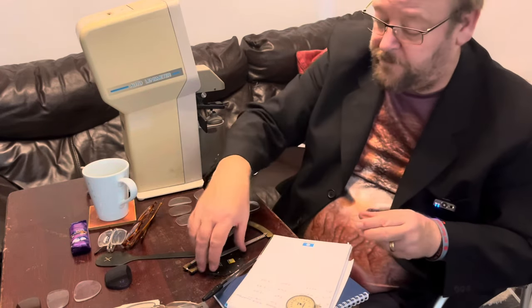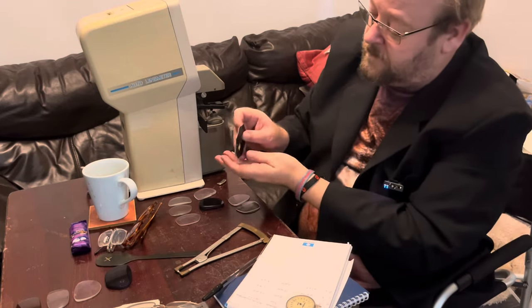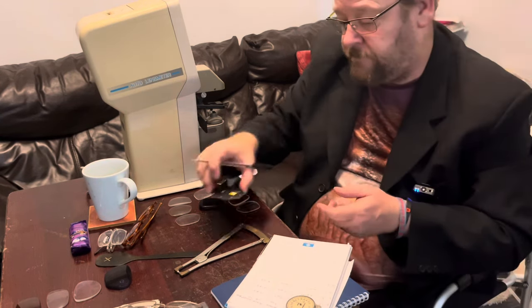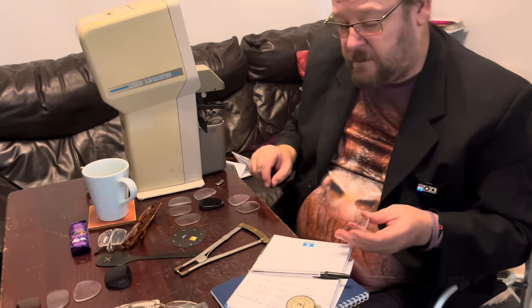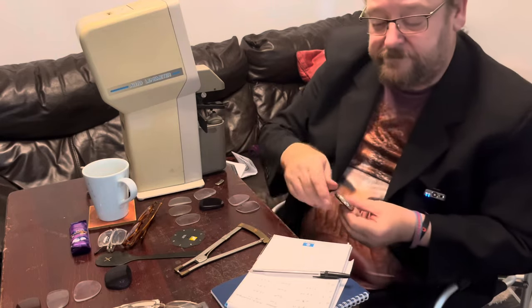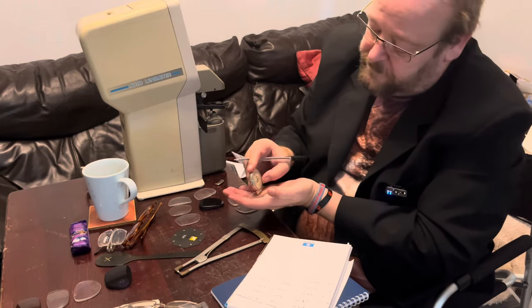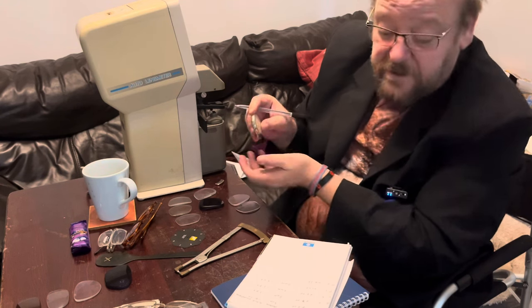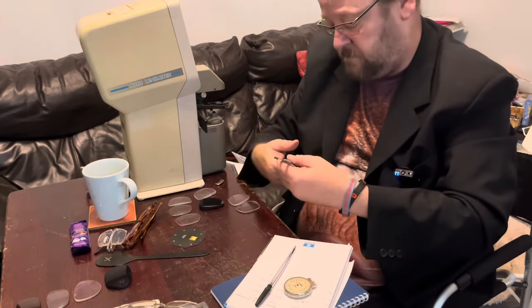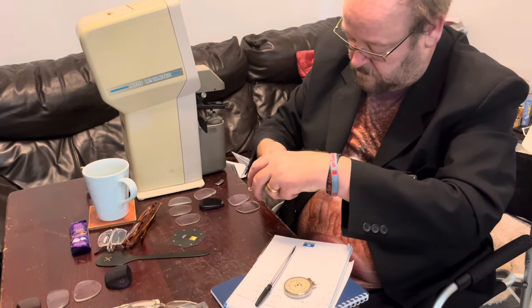Moving on to my next lens. So I'm measuring the front curve again — that one is two. I'll now measure the front surface of the lens and that one is plus 4.25. And the back surface is minus four. And now for the center thickness — that's three millimeters.